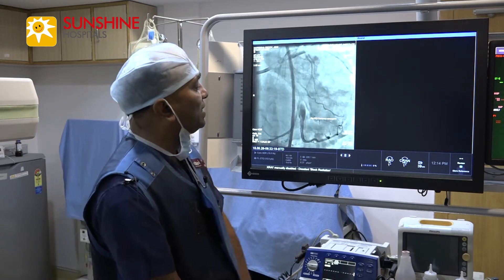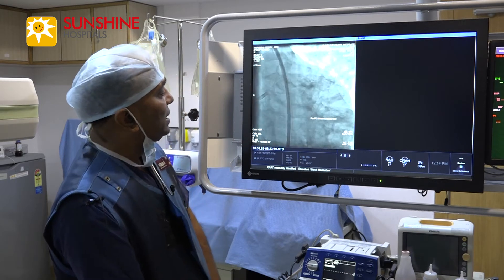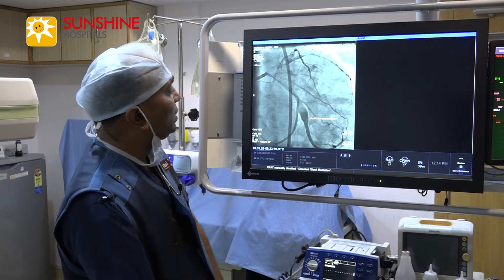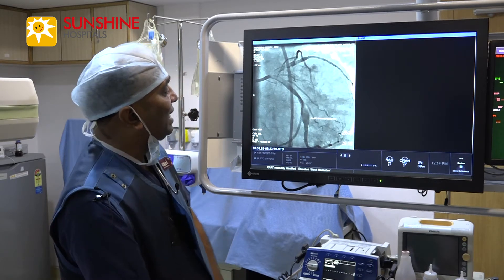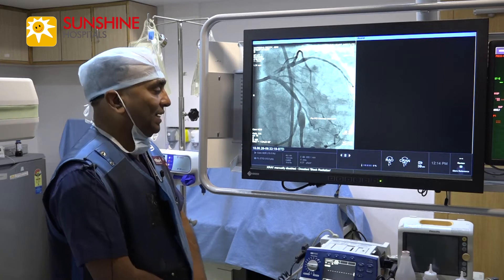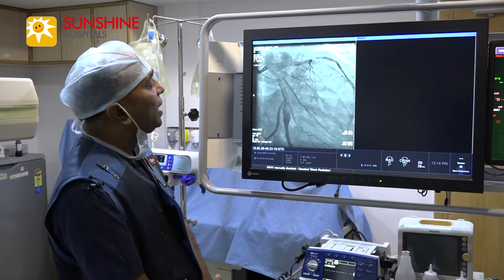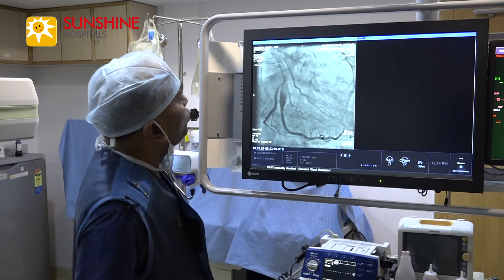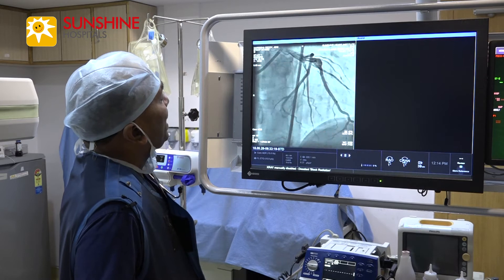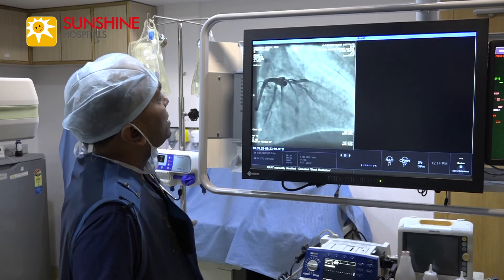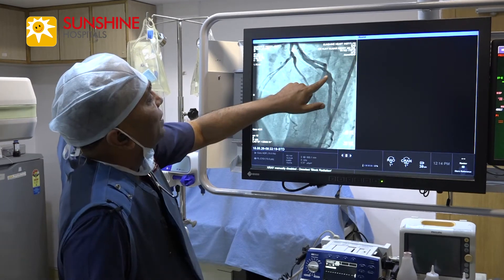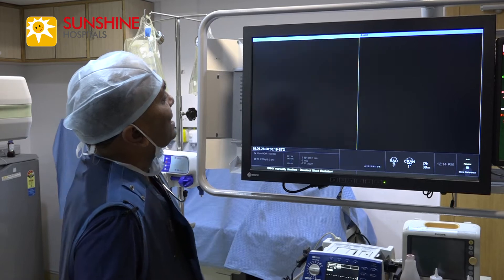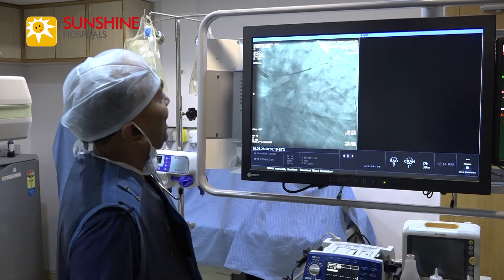Angiogram shows there is a giant aneurysm of the left circumflex artery. Here we have taken two views — apicaudal and apicranial views — showing a very giant aneurysm of the left circumflex artery.